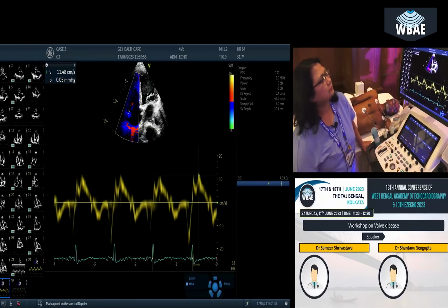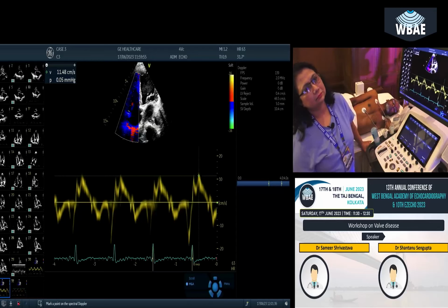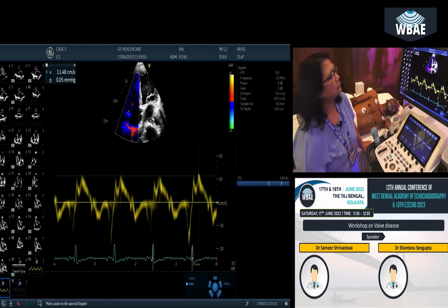That's all. This is what it is. And these are biphasic isovolumic phases, isovolumic relaxation. What happens is sometimes if we increase the gain or decrease the gain, the values change a lot. So that's exactly what Dr. Mohan is trying to tell: you have to visualize the gains, but take three or four modal waves and check the modal velocity. Modal velocity is a fairly good idea.